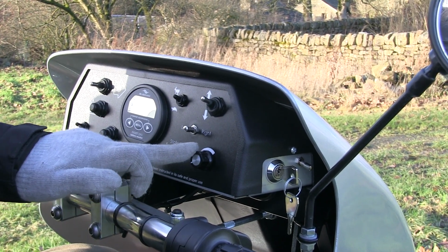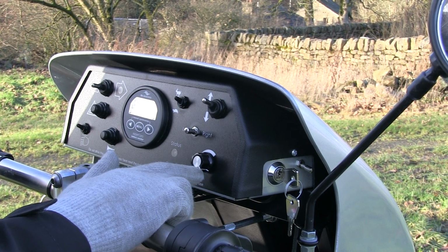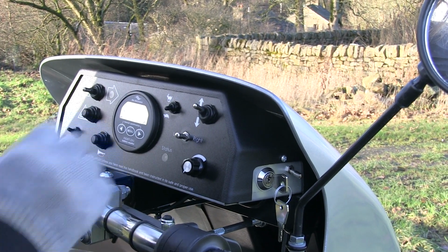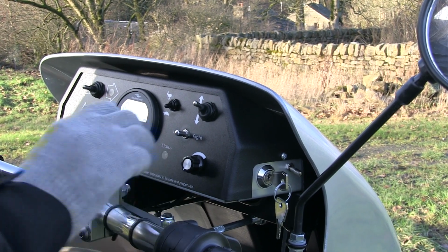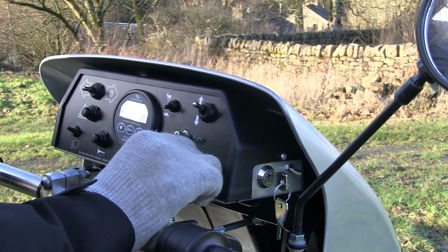The dial here in the bottom right is like the accelerator, which is just literally a twist in the clockwise direction that increases the speed. So when you start, you're much better to have the Tramper in the tortoise, which just clicks down and the dial turns right down. As you get more confident, you can just simply adjust the speed as you're moving, and that will increase as you're moving forward.